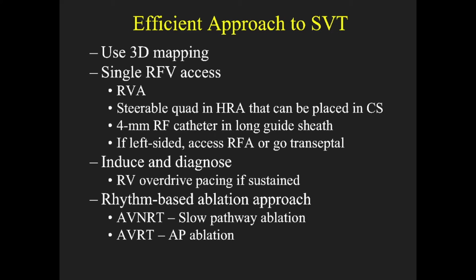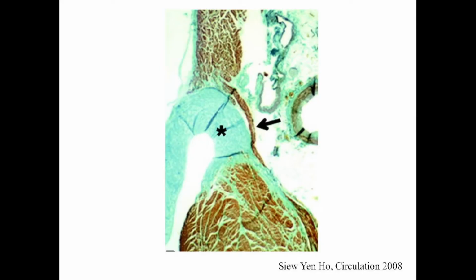Occasionally, you'll have to go within the coronary sinus to ablate a pathway. But this also shows you why if you come retrograde and get underneath the aortic valve, you get good stability and heating, although it's harder to manipulate the catheter than if you go transseptal and you come up here. You can access the entire annulus more easily, but you tend to not have the same amount of contact and heating. So it kind of shows you transseptal versus retrograde and what a very thin fiber this is. There are very few actual histological examples in the literature of an accessory pathway.